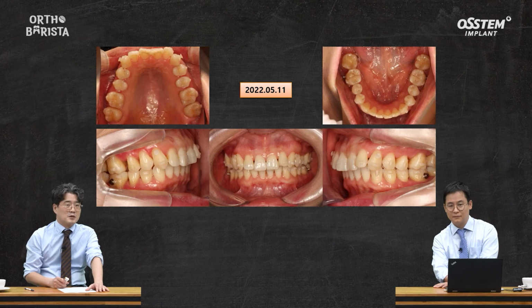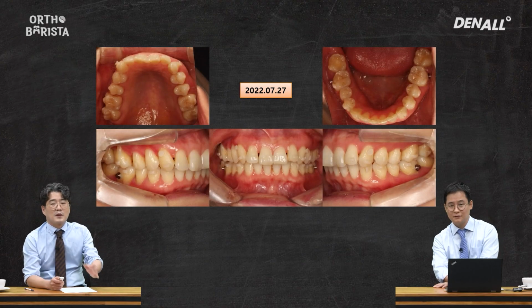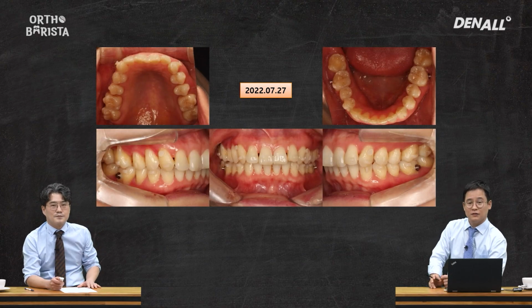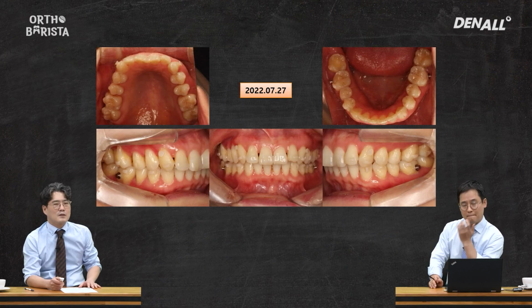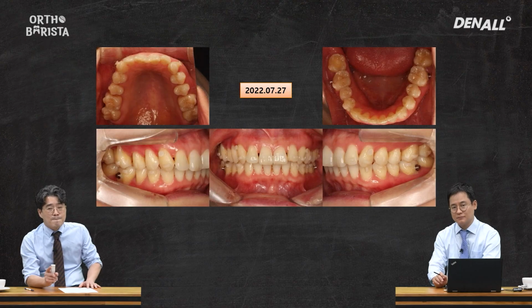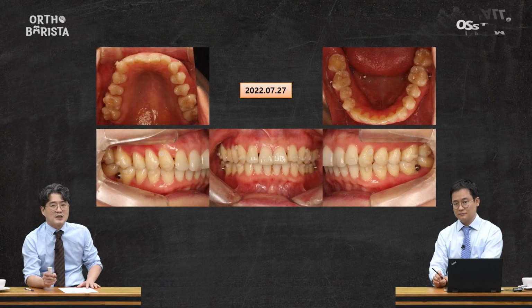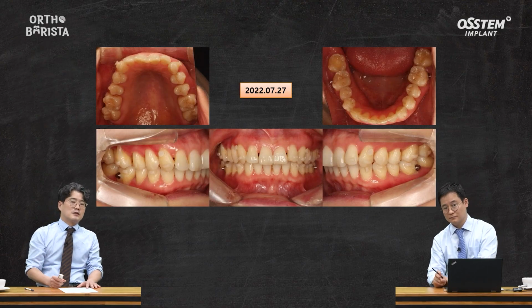These are so-called butterfly teeth, aren't they? Yes. And correction does not seem easy. So if you look at the July status, there has been much improvement in the bite. Right, I think it is really good for addressing the deep bite. It really is. The full cusp class 2 has not yet perfectly been addressed, but if you look at the posterior region, you can see gradual improvements.